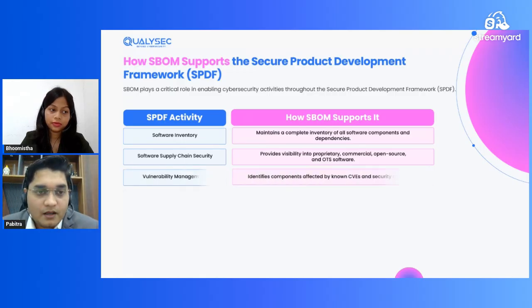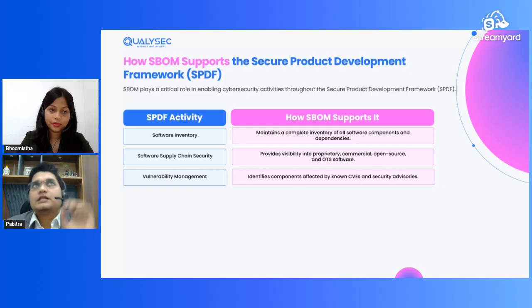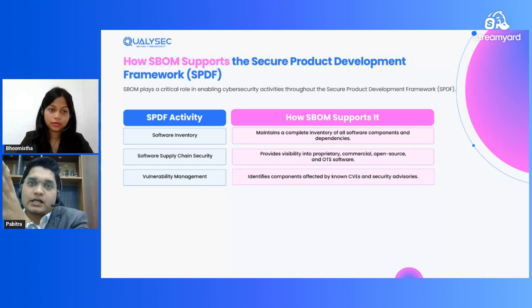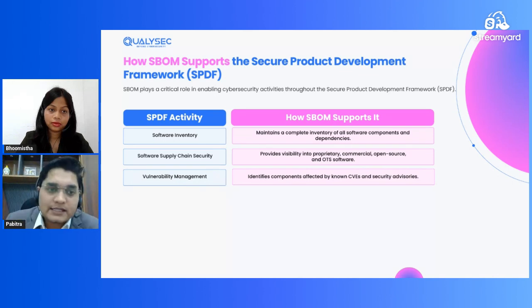Moving on to vulnerability management. Since in the SBOM we know this component is being used and this is its version name, we know that this particular CVE is affecting it. So for managing vulnerabilities, this is also going to help.